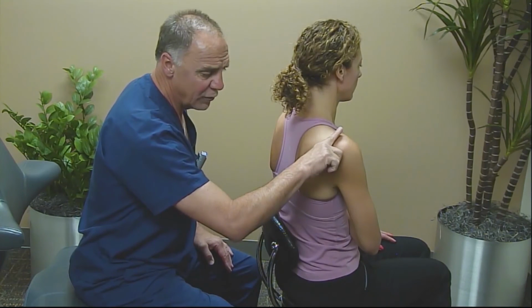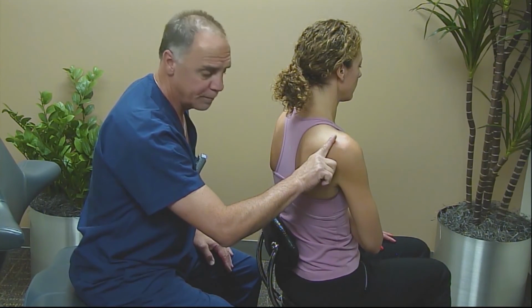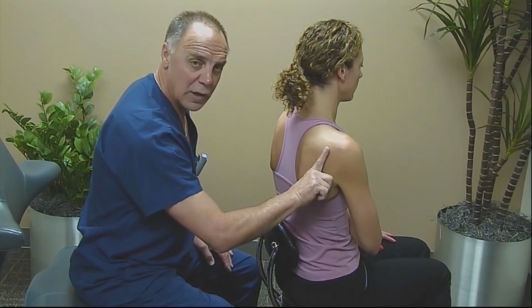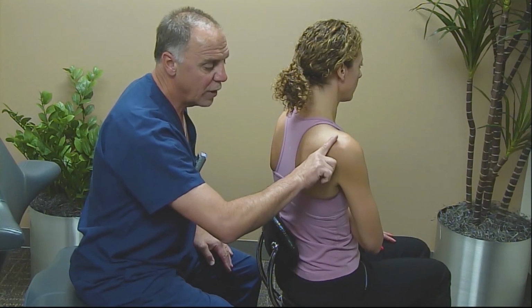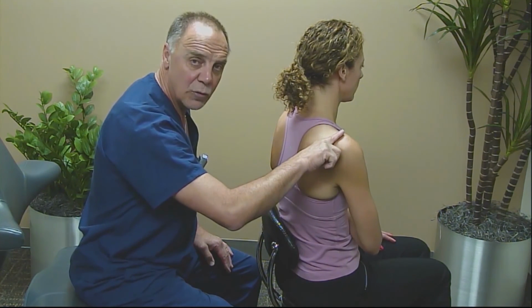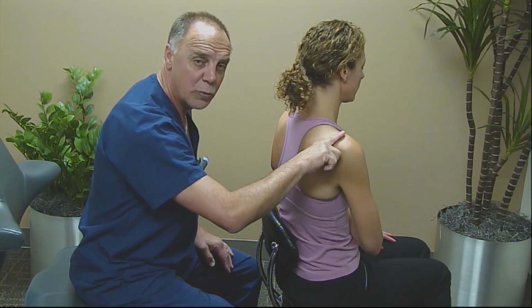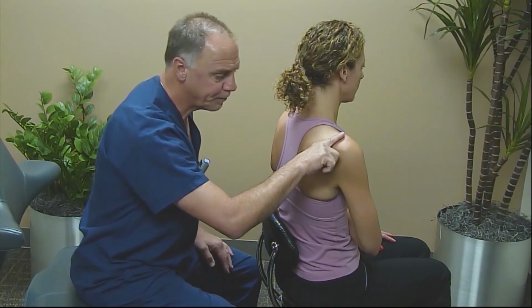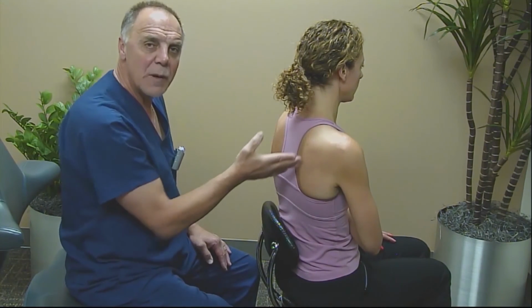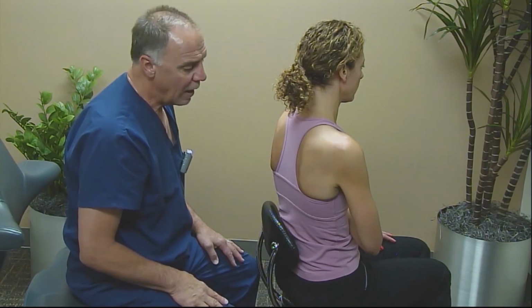We'll place our transducer on top of the spine of the scapula and look down into the short axis of the muscle belly of the infraspinatus. And we'll also move the transducer anterior to the spine of the scapula and look at the short axis of the supraspinatus muscle at that point. Those would be the positions that we would have the arm in to look for evaluation of the tendon.